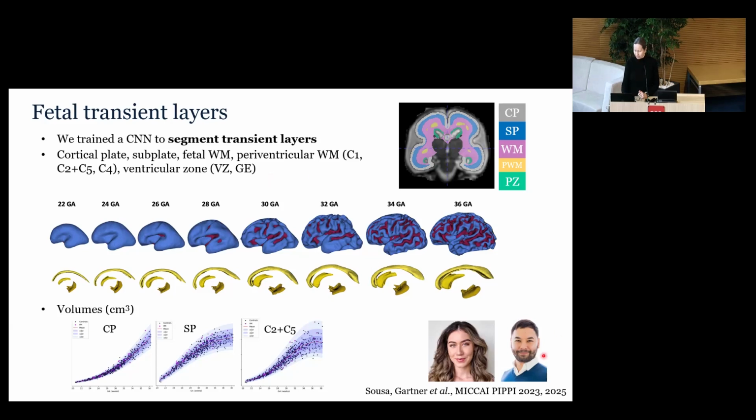We also get lots of help from Abby Gardner, who did the segmentations for us according to a histological atlas in the spatiotemporal atlas space. I love this 3D visualization because this blue surface, that's the subplate, okay? That's not cortex, that's subplate. And you can see at the beginning, it's completely continuous.